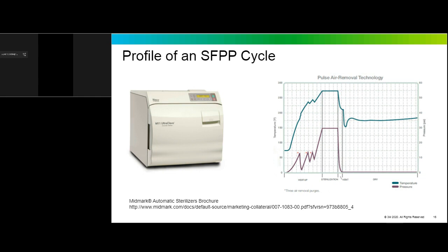Many tabletop sterilizers now employ steam flush pressure pulse sterilization cycles, as it offers a more efficient method of air removal than a simple gravity sterilizer would have.